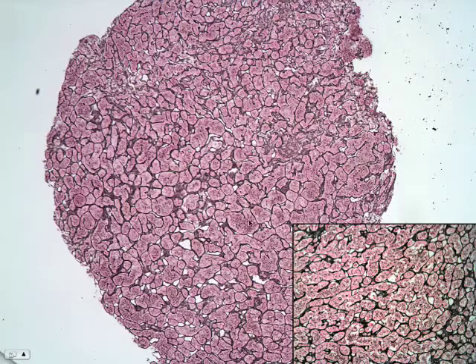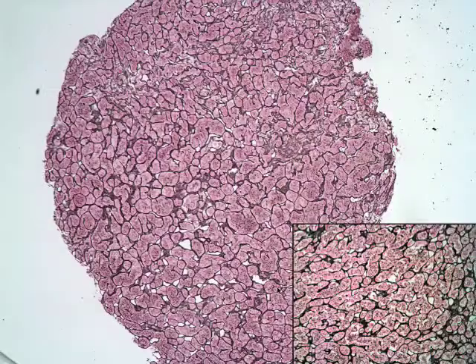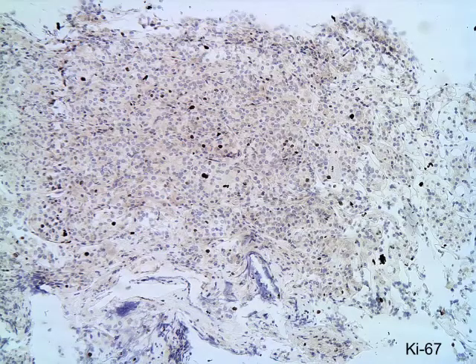These nests are getting to be a little bit big. I didn't photograph the stains on that because I think that's way too close to normal to try to claim that that's part of the adenoma, and the stains did come out on the adenoma. It looks to me like it is, but there's also frank adenoma in other places, so I didn't really want to muddy the discussion of what might have stained, because the stains are also kind of equivocal, and then if I go to a part that's even equivocal for hyperplasia, then there's too many questions.